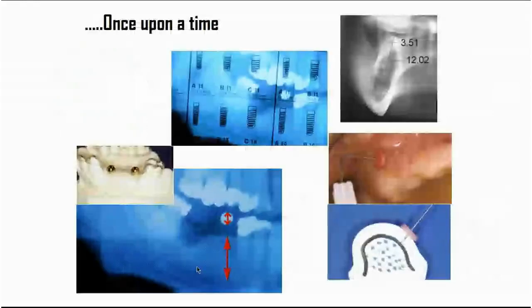My first contact with implantology was with this kind of X-ray pictures, and these clinical actions you can see on the slide were really necessary so you could try to assess and decide what kind of clinical action you would need to do.